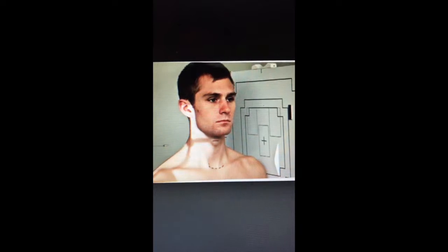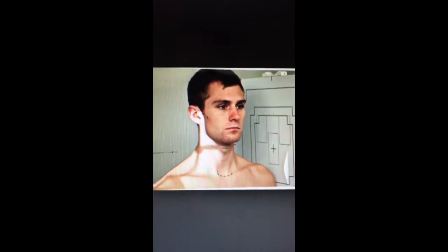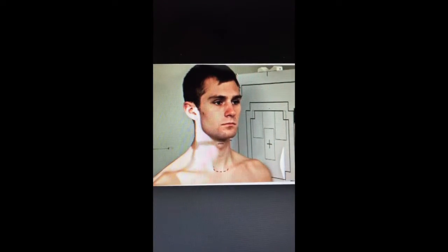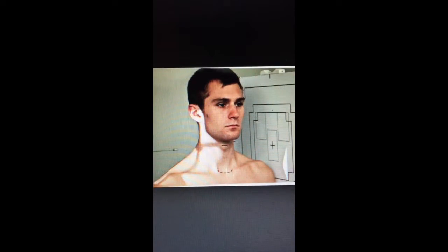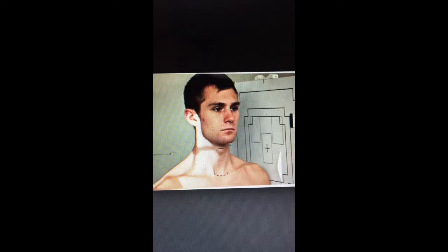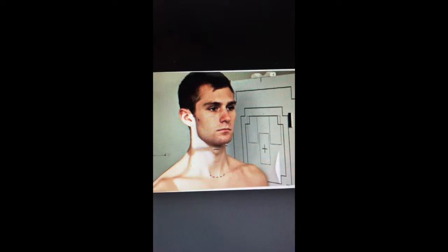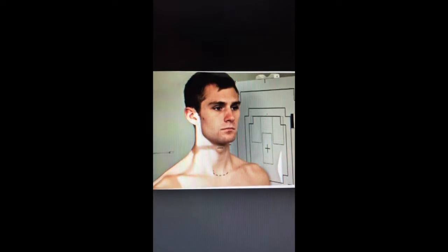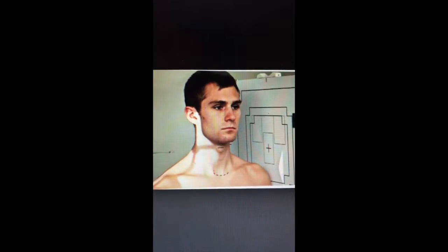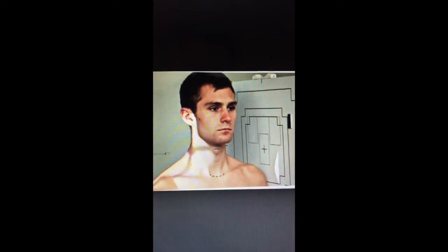In this position, the patient needs to be on the lateral. In order to get the C-spine, the patient needs to be on a true lateral. The patient needs to relax and drop the shoulders down in order for the ribs not to superimpose C7. The CR needs to be centered to C4. It has to be perpendicular to the IR.